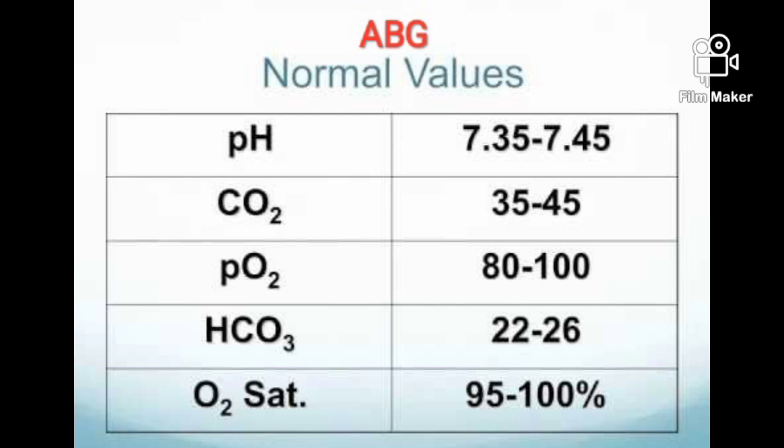If the anion gap is elevated, consider calculating the osmolar gap in compatible clinical situations. Elevation in anion gap is not explained by an obvious cause such as DKA, lactic acidosis, and renal failure. Toxic ingestion is suspected also in the highly elevated anion gap. Osmolar gap equals the measured osmolarity minus 2 times sodium minus glucose divided by 18 minus BUN divided by 2.8. The osmolar gap should be less than 10.